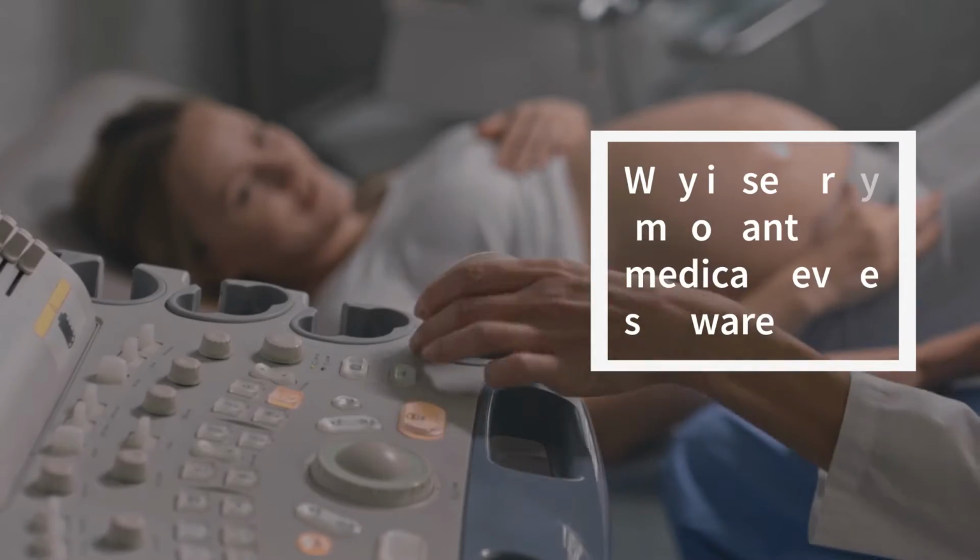Another thing we need to do is look at communication at the edge of the device. What does it need to communicate with, and how do we ensure that that communication is secure and authorized?